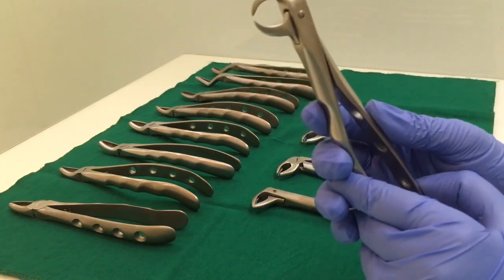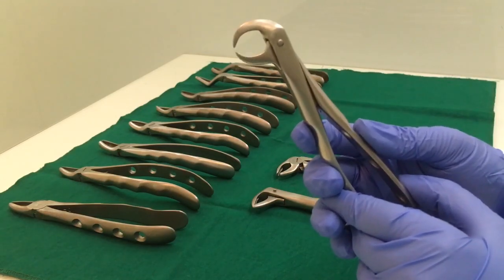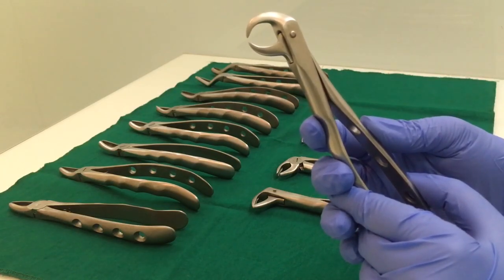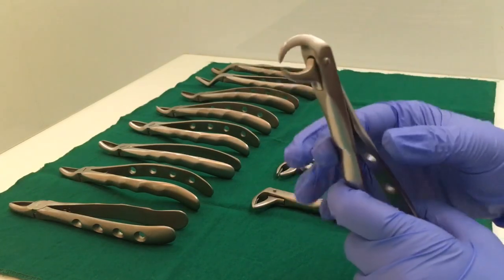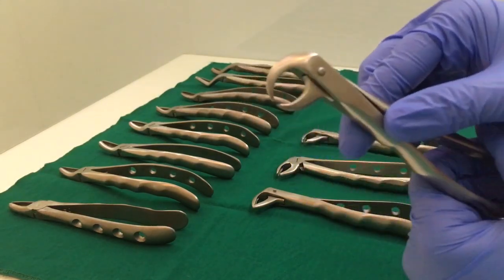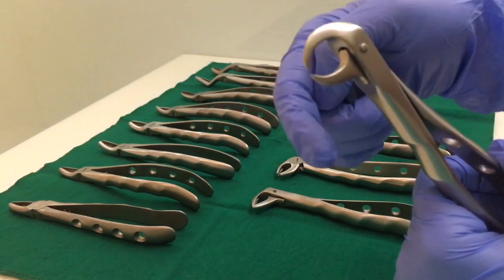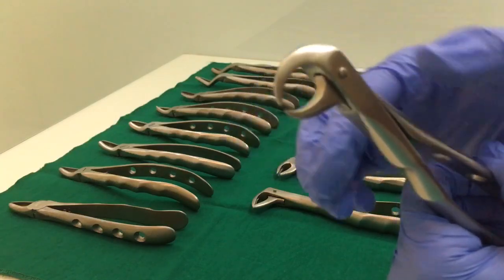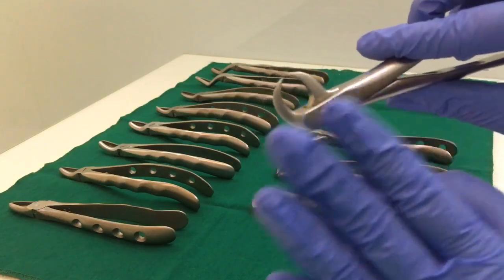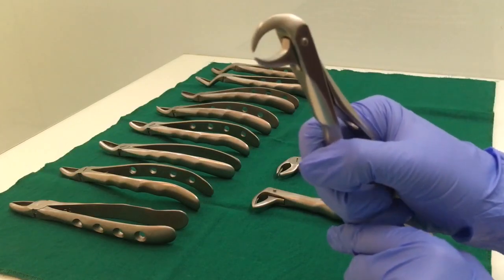This is your lower cowhorn forceps. It is used for removal of grossly decayed teeth with their furcation intact — mainly used for the lower molars. The shape of the beak is very distinctive here: it looks like the horn of a cow. This is your lower cowhorn forceps.